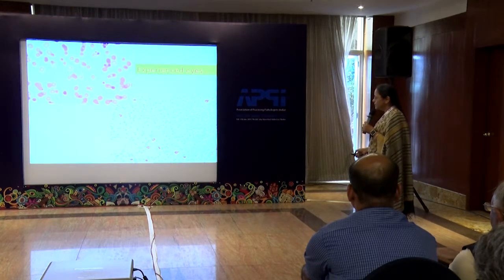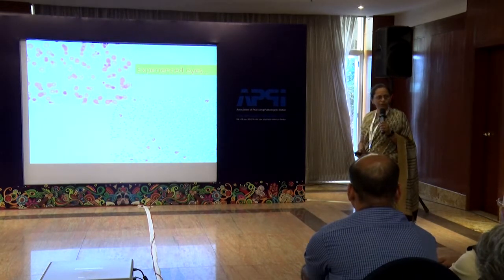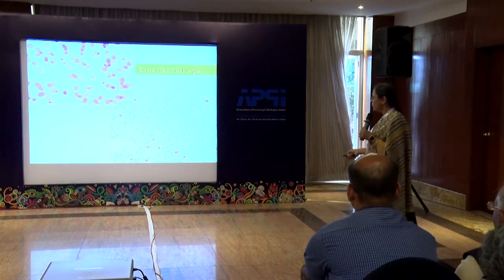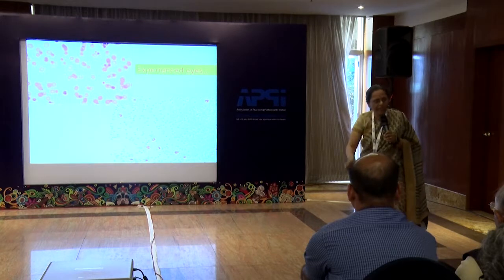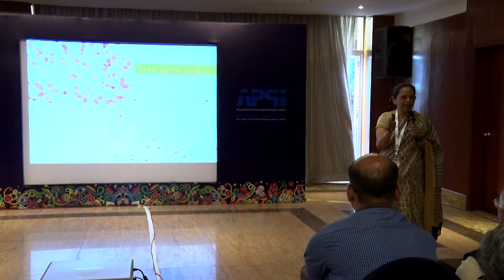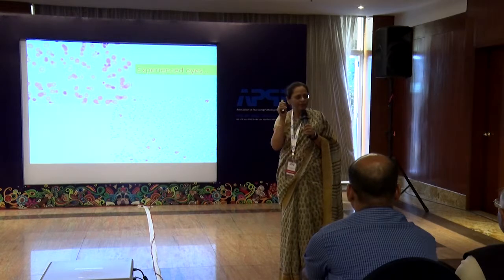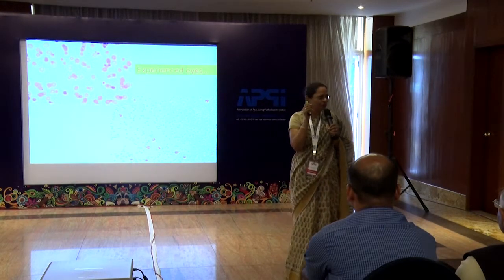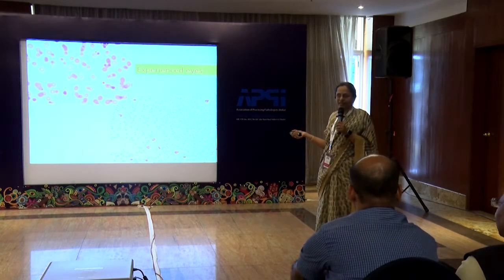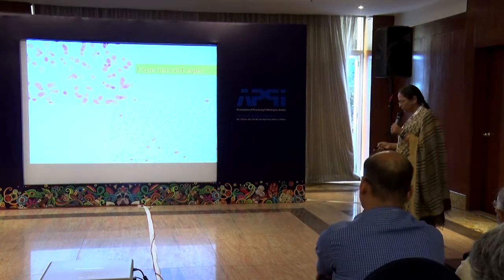Do you agree that these red cells are not normal? Okay, so it's a classic picture. Now can you tell me what you would do? G6PD. These are the classic moth-eaten cells. So if you saw this, you can just pick up the phone and talk to the physician. Even if he has not given you the diagnosis, the clinical picture, you can ask him, is this a child, a boy? Has he been treated for fever? Has he been treated for malaria? And you would get a classical history. So a good trained eye, morphology is your strength. Do not ever forget that.